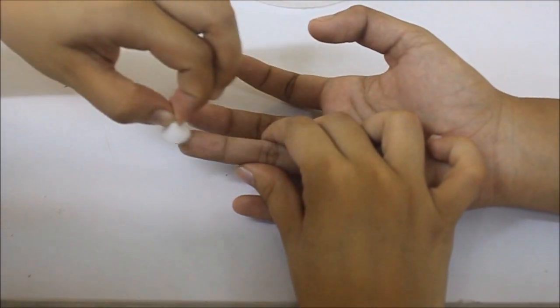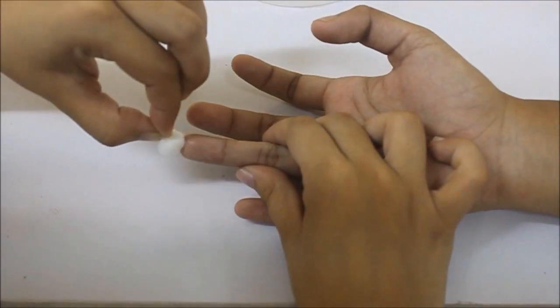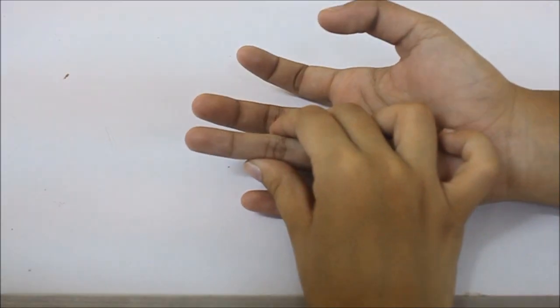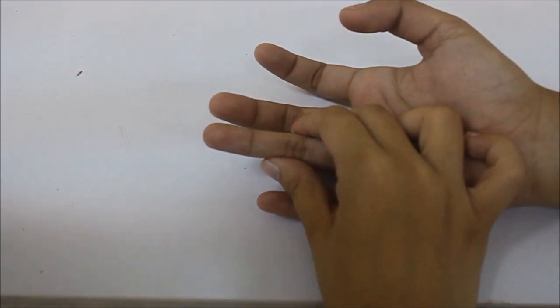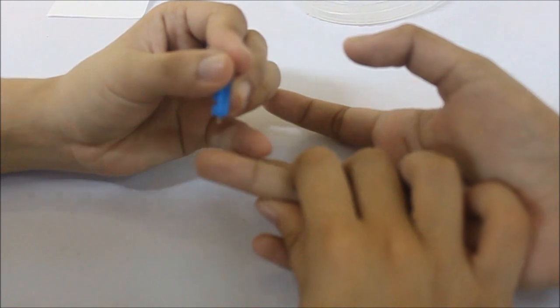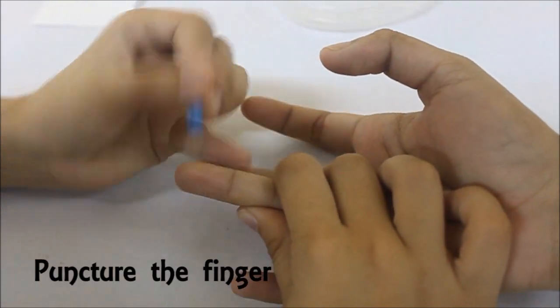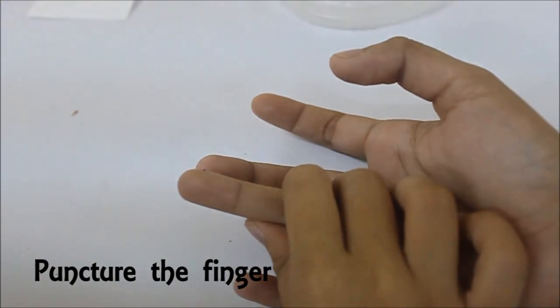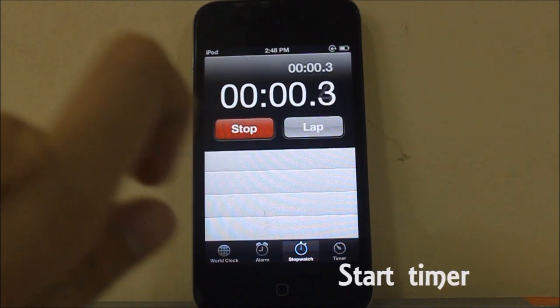Sterilize the patient's middle finger with 70% alcohol. Allow about 1 minute to elapse so that the finger will dry. Using a sterile lancet, puncture the finger to about 2-3 mm deep and start the stopwatch.